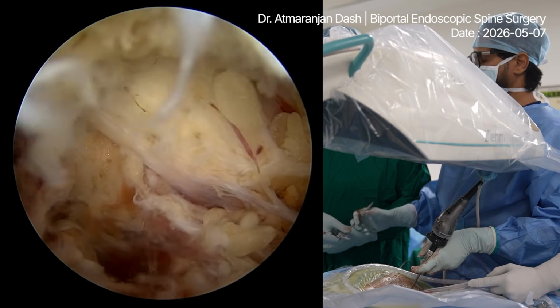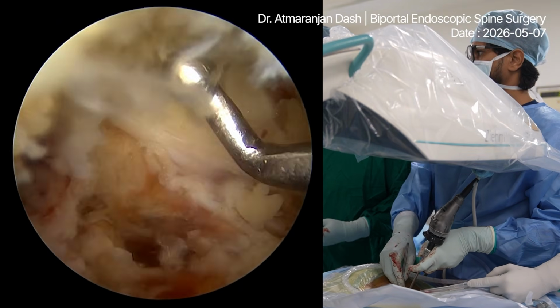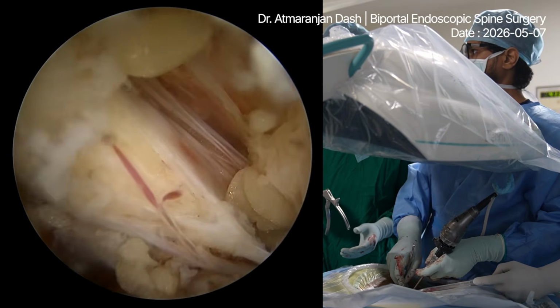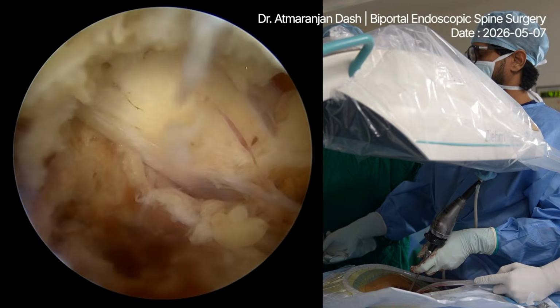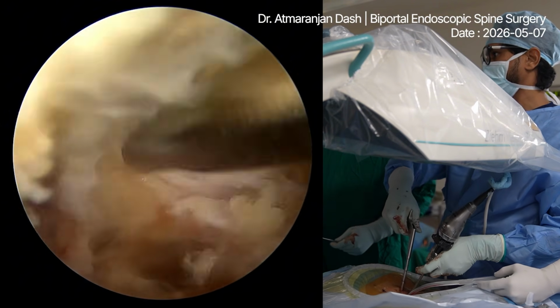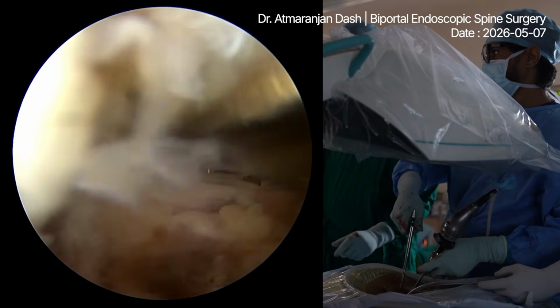You see the root, it was already exposed. Give me the rotating carrison. Carrison. So the root is already exposed from the previous surgery.